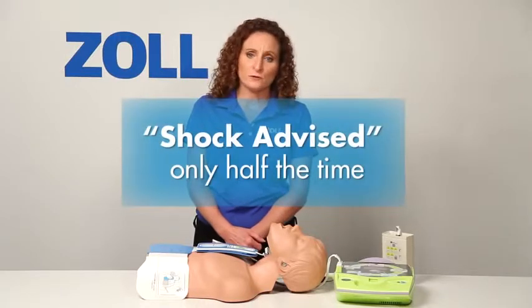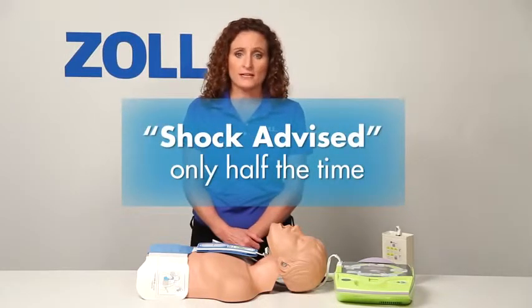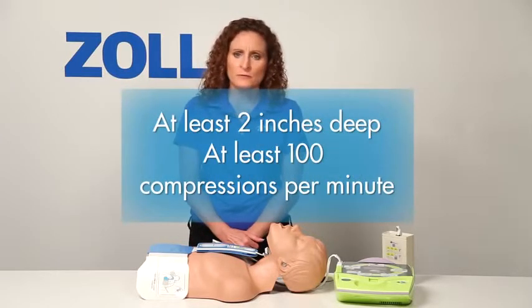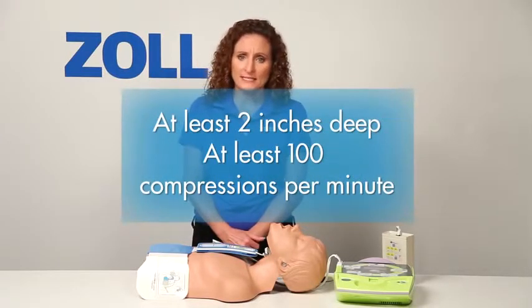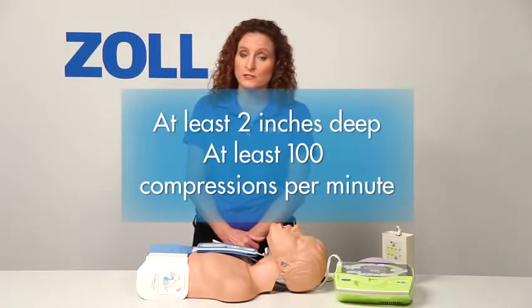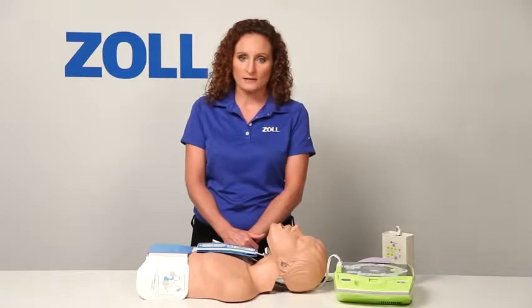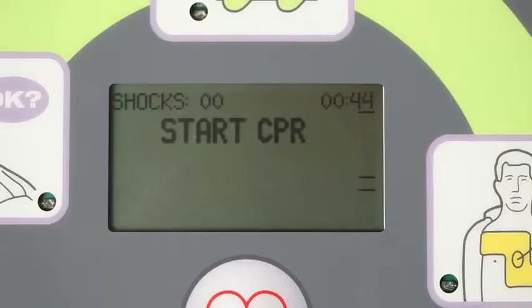Half of all rescues with an AED start with no shock advised. Perform good CPR with chest compressions that are at least 2 inches deep at a rate of 100 compressions per minute, and the next analysis may tell you to deliver a shock. The AED Plus repeats the prompt to start CPR every 10 seconds.